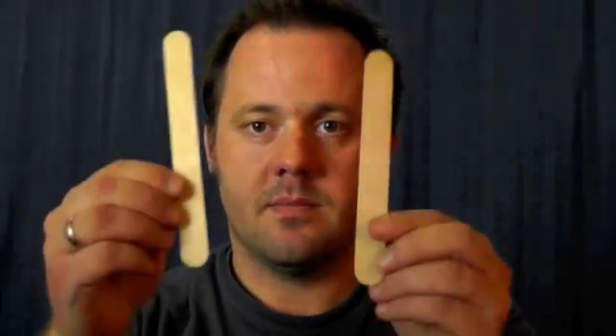The way to overcome this is with a really simple technique: two tongue depressors and a roll of tape. When I see a patient coming into the emergency department with a nosebleed — whether at triage, being wheeled in on an ambulance trolley, or even walking past a cubicle — I go and get two tongue depressors and a roll of tape. About a third of the way down, I start rolling the tape and taping the two tongue depressors together.